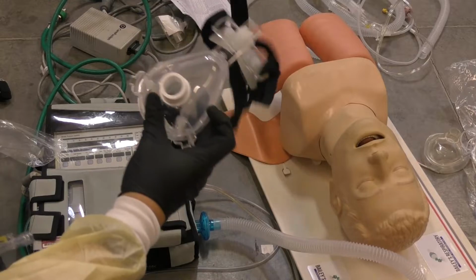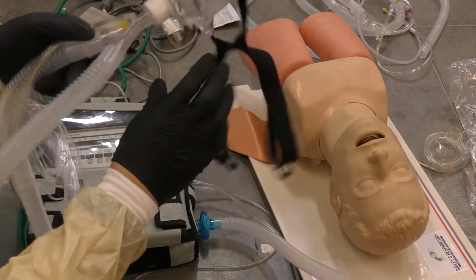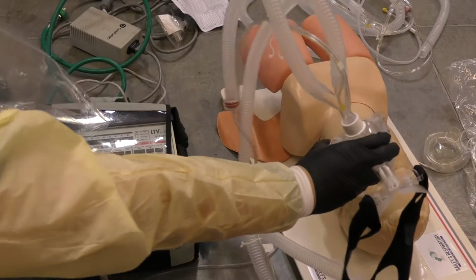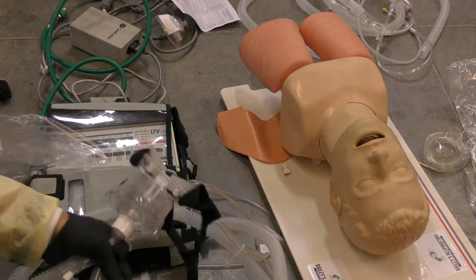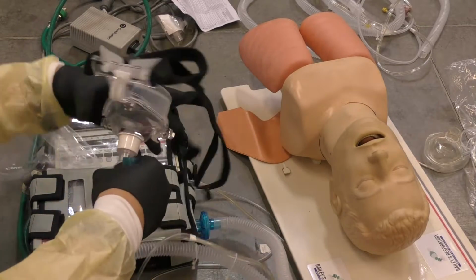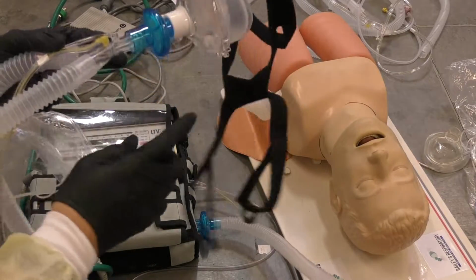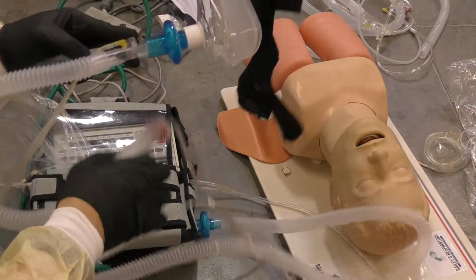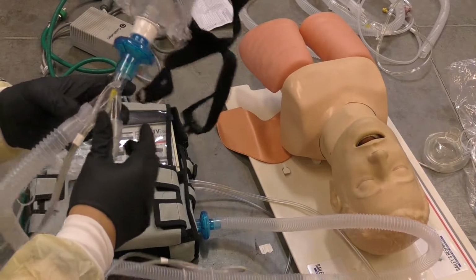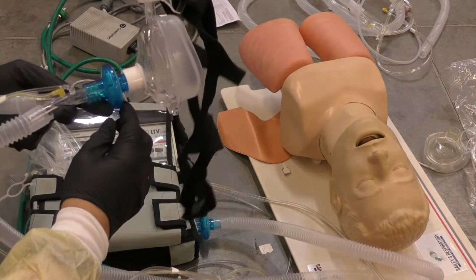So using an LTV as a BiPAP, same thing applies. Typically we're putting it like this and putting it on our patient. But for this to protect us, we want to put our bacterial viral filter in line like this. Because again, here's our exhalation port, and yes, it will create some airway resistance problems, but you just have to work through them.